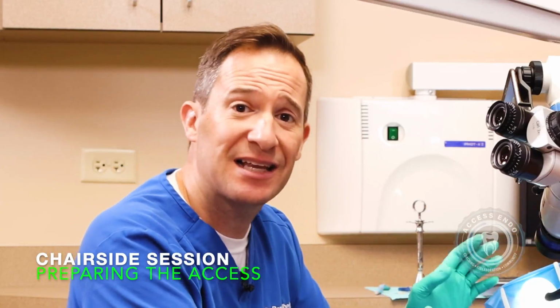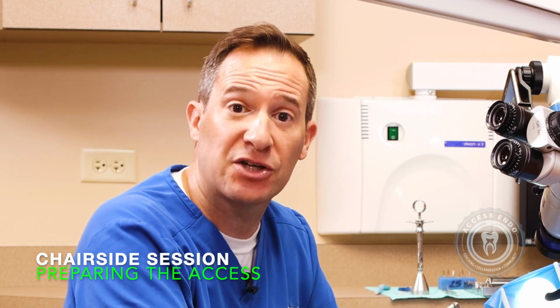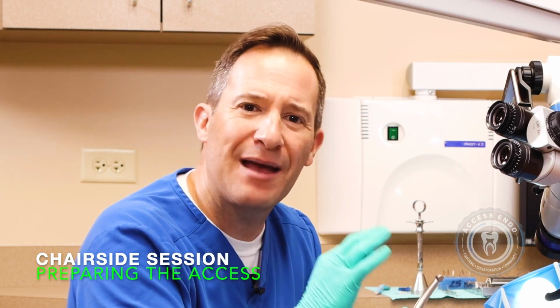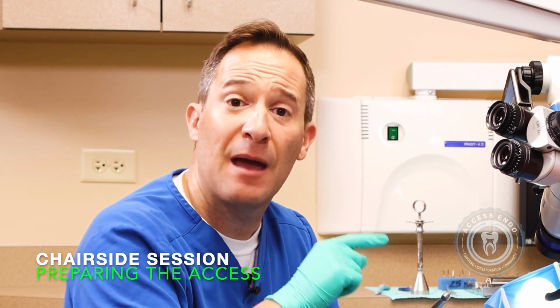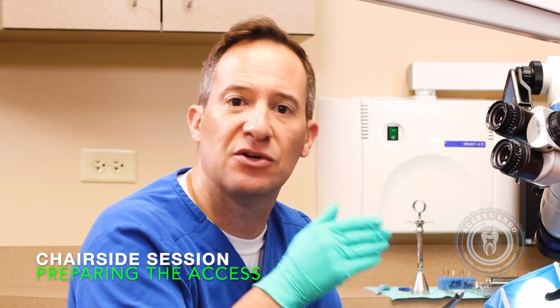Now, if you start to sink this burr down and you're not finding the pulp chamber that you saw on the x-ray, you have to stop and critically think: why am I not in the pulp chamber even though I've cut a lot of dentin out of the way? Most likely, you're heading in the wrong direction, down to the mesial or to the distal.